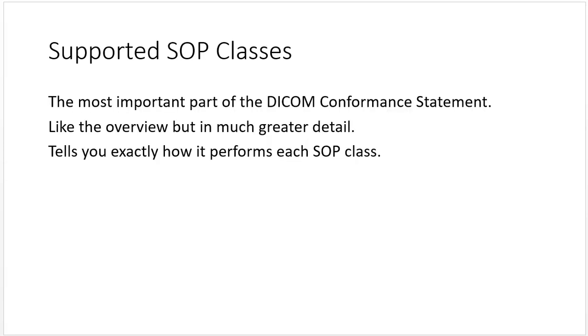And last but not least is the supported SOP classes. This is the most important part of the DICOM conformance statement. This will tell you the exact sequence of every DICOM communication. It takes time to review, but you want to make sure it matches up with your PACS DICOM conformance statement. Otherwise, you might waste a day trying to send a PDF from the bone density unit. Not that that's ever happened to me.